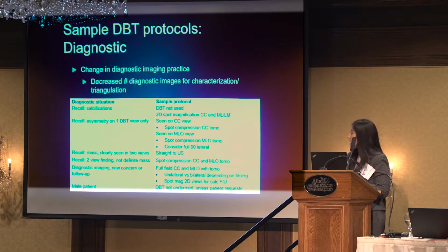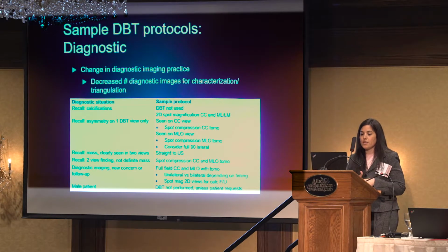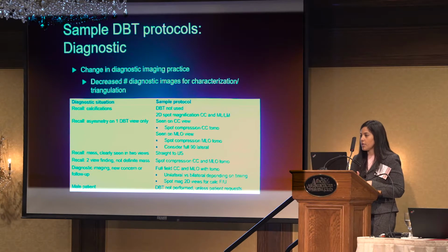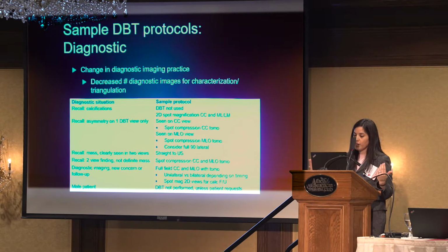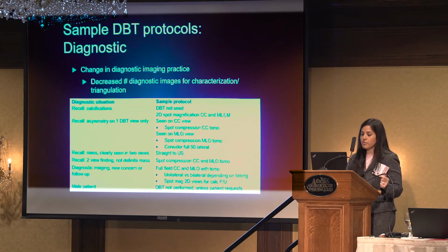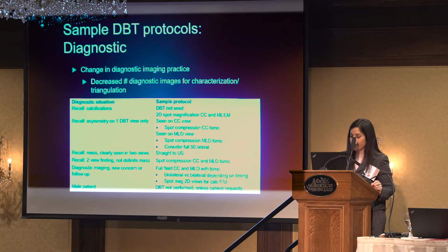In terms of diagnostic imaging protocols, really we've seen a shift in our diagnostic practice. We're decreasing the number of diagnostic images that are needed. Like we talked about before, you don't need as many spot views, you don't need rolled views, the only thing you still need is magnification views for calcifications. So if we recall a woman for calcifications on a screening mammogram, we're only going to do the spot mag views. You don't need any other views unless there's something else.